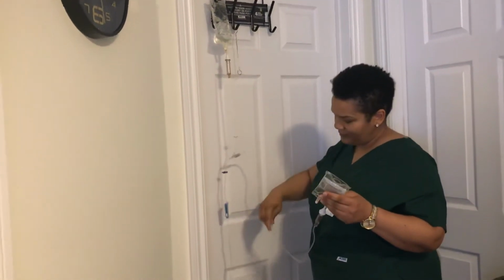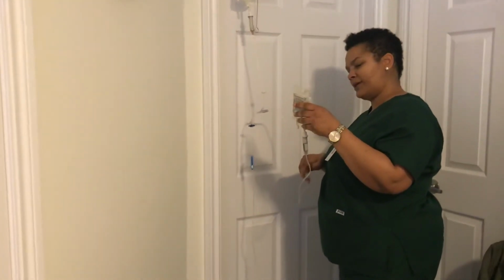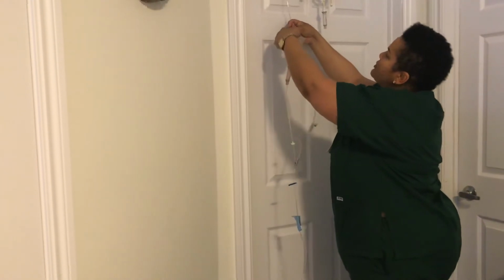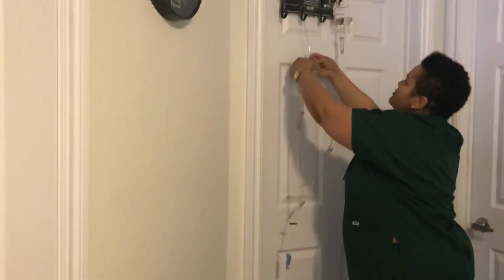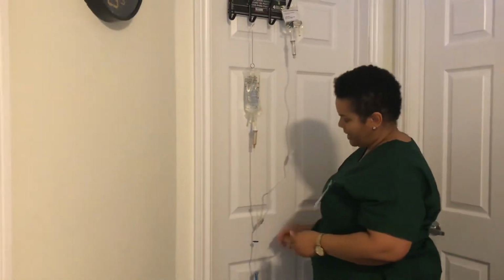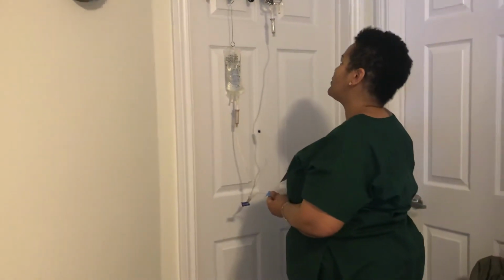and I'm going to open the clamp to make sure that the drip chamber is filled halfway. And once that's done, I'm going to close the clamp again, hang up the bag, and now I'm going to drop my mainline bag on the hanger so that my mini bag solution drops by gravity first. So once I've dropped the main bag, I'm going to open the mini bag clamp completely open. I'm going to open it up, and now I'm going to regulate the drops per minute, looking at the drip chamber on the mini bag, ensuring that I get 20 GTT per minute.